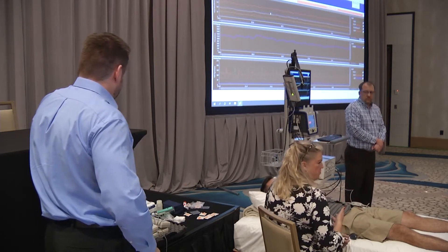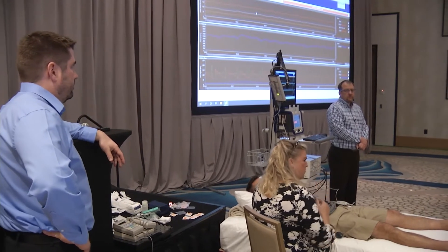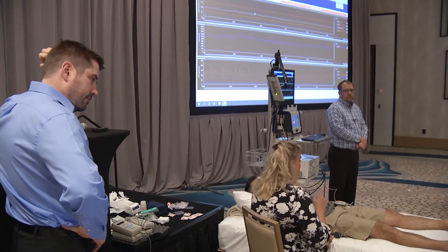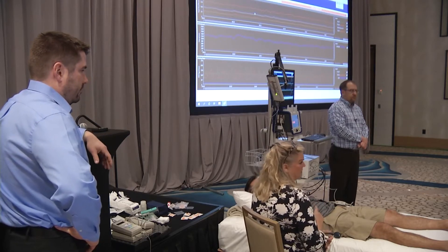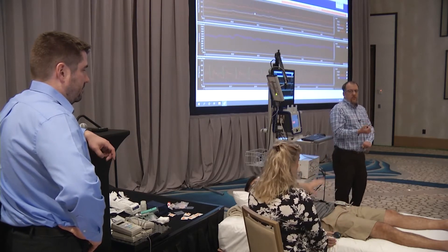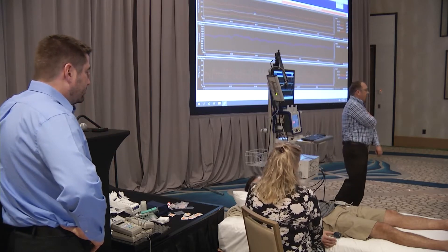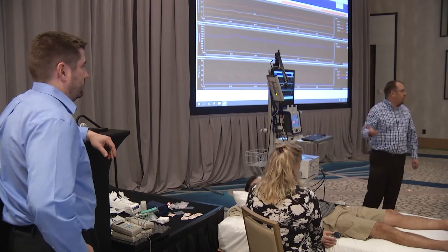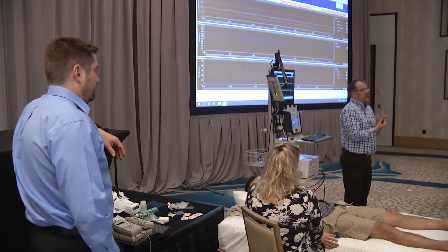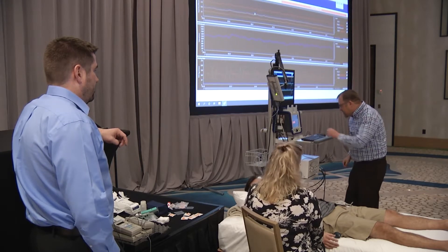In the lab, especially during a drug study where we want to see change, we also try to get them to match. I palpated his pressure at 118, but he says he's really cold, which can cause vasoconstriction in the hands. One thing we can do is retake an upper arm cuff reading to see if the device has drifted, since the Valsalva maneuver or movement could have shifted the finger cuff slightly.